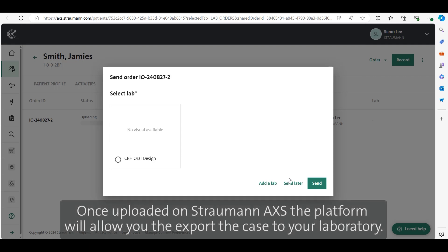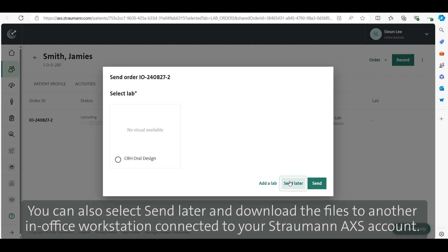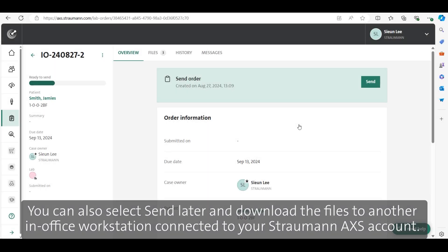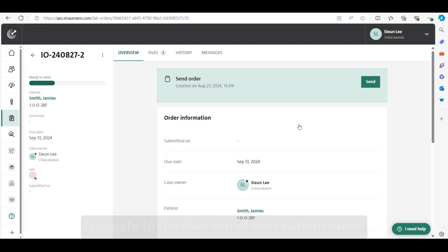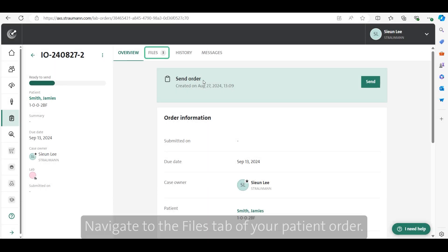Once uploaded on Straumann Access, the platform will allow you to export the case to your laboratory. You can also select 'Send Later' and download the files to another in-office workstation connected to your Straumann Access account. Navigate to the Files tab of your patient order.